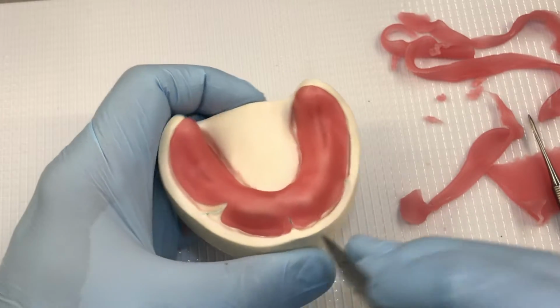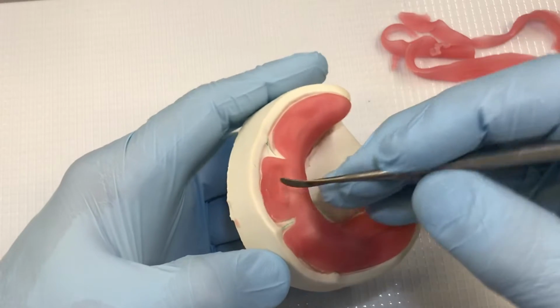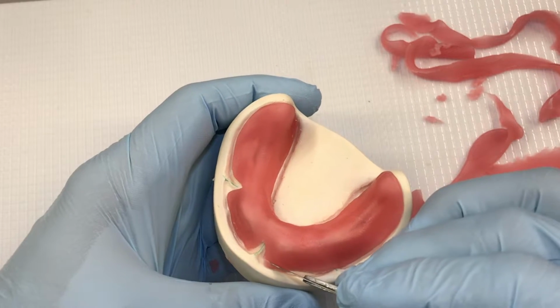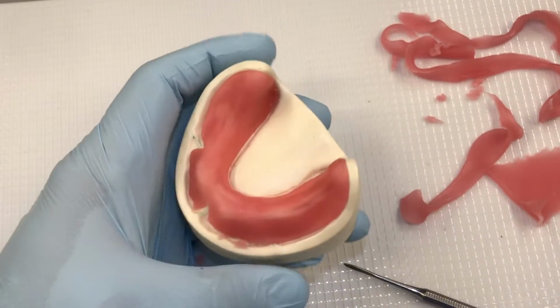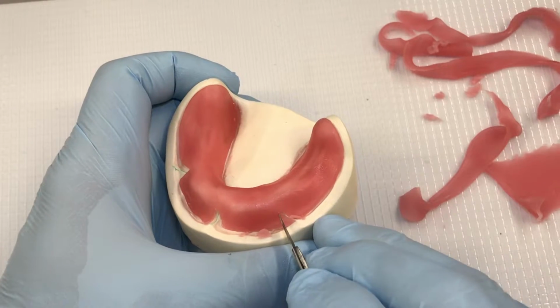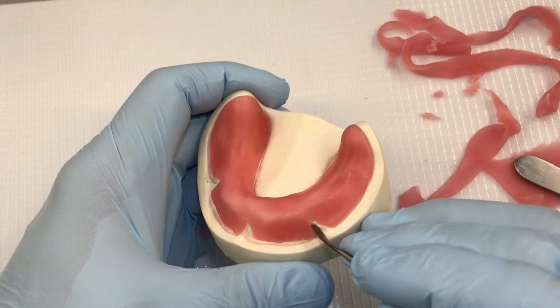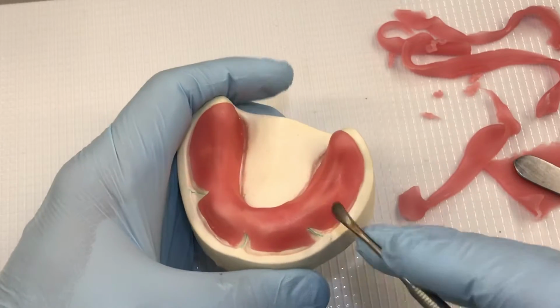I'm going to open this one up too. No different than we used to do it with our custom trays. A little excessive on this one, but let's go back and readapt and close that up. So a lot of forgiveness in the material on how you manipulate it. And finally, we'll do the left buccal frenum here. Clean off some of the excess material again. And round off the frenums. So there's very little trimming to do. We're going to do some, but let's minimize it.